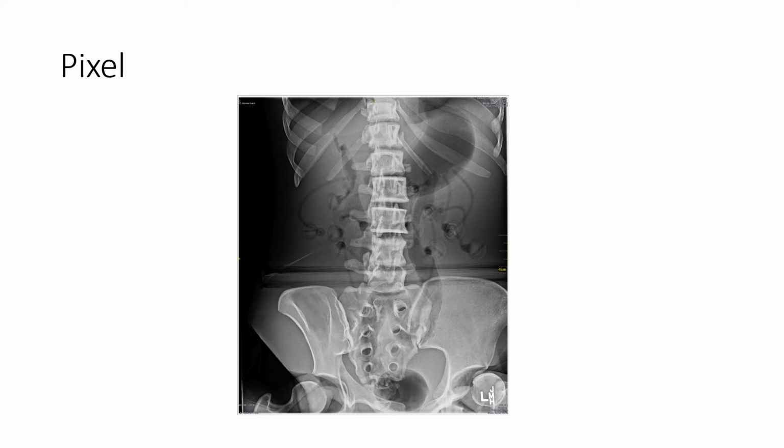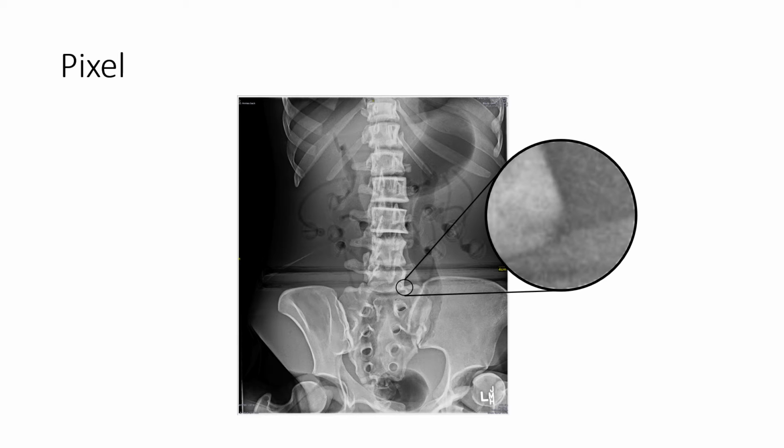If there is any question as to what a pixel is, look closely at the computer screen and you will see that it is made up of small dots. For today's monitors, you may need a magnifying glass. These dots are called pixels. All radiographic images are made up of pixels. The number of pixels in any imaging plate may vary by manufacturer.